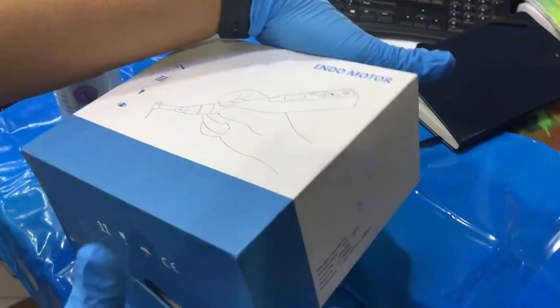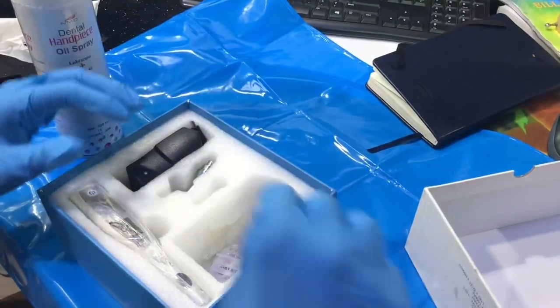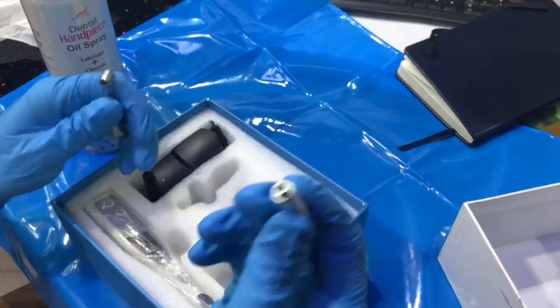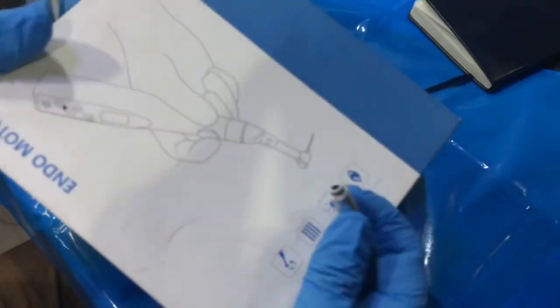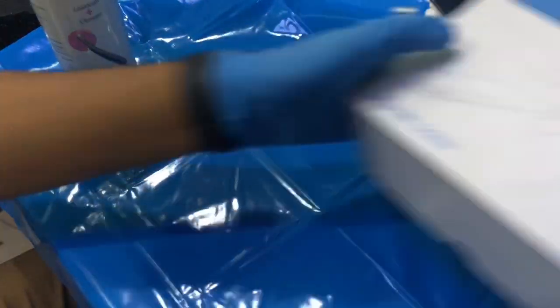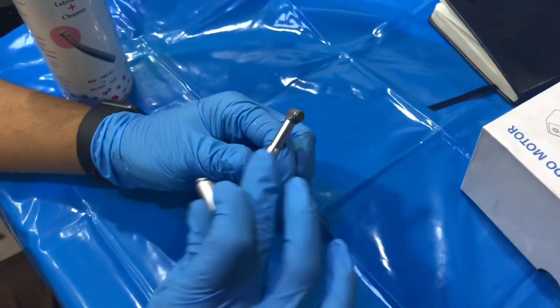You must have noticed in your box you have a small part. You must have questioned yourself what it's used for. This is basically to lubricate and maintain your handpiece.